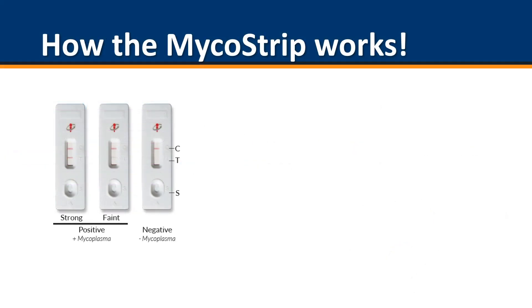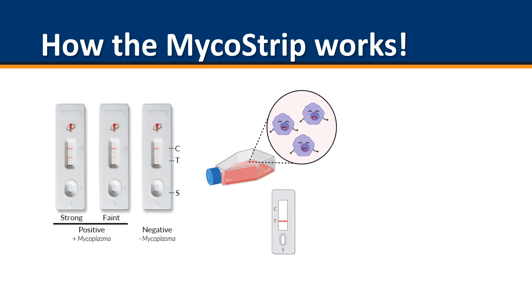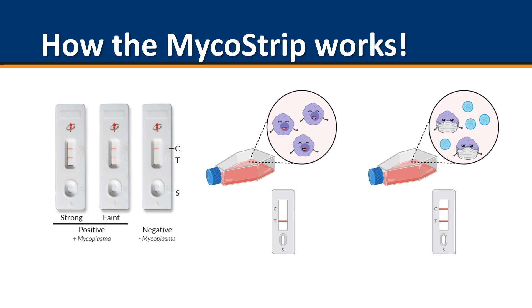So how does the Micostrip work? The results are extraordinarily simple to interpret. A single line indicates that your cultures are negative for mycoplasma contamination. Whereas two lines, whether strong or faint, indicates that your cultures have mycoplasma contamination.